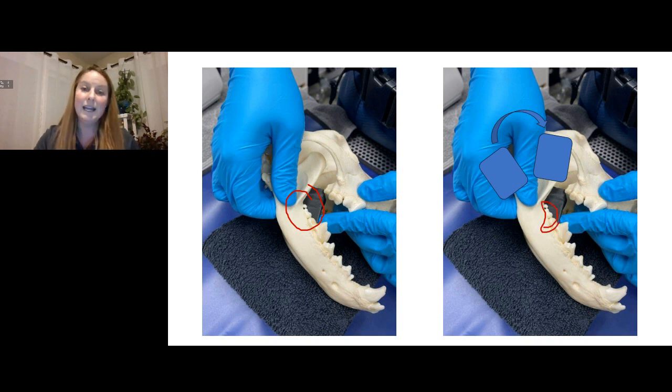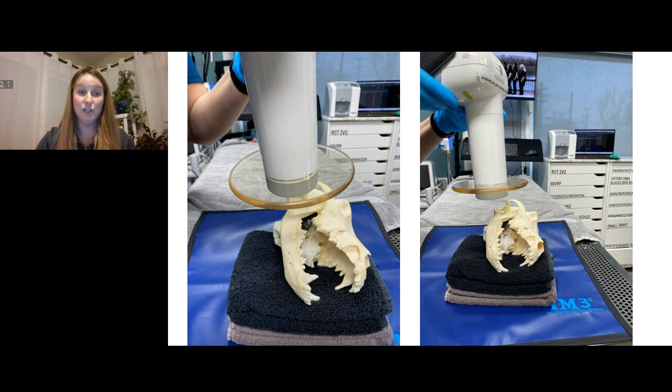And in order to get them, this direction is how a lot of people like to try to shove their plate in, further and further back. Well, if all you do is push the plate in further and further back, you're not going to get your image. However, if you take that plate and you push this corner down with your finger like this right here, then when you try to view those teeth, they're actually going to show up. So you can take that image like this.